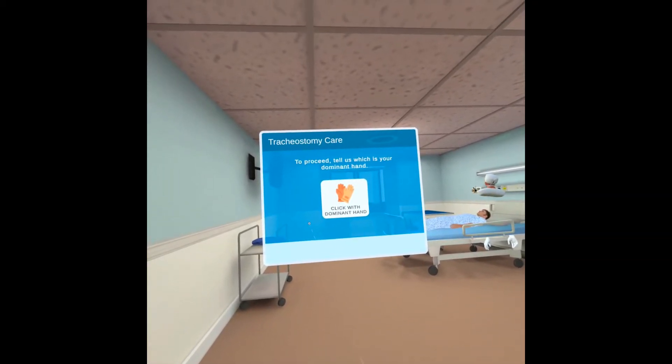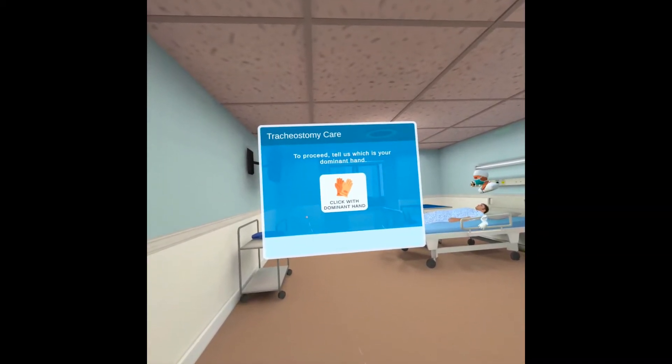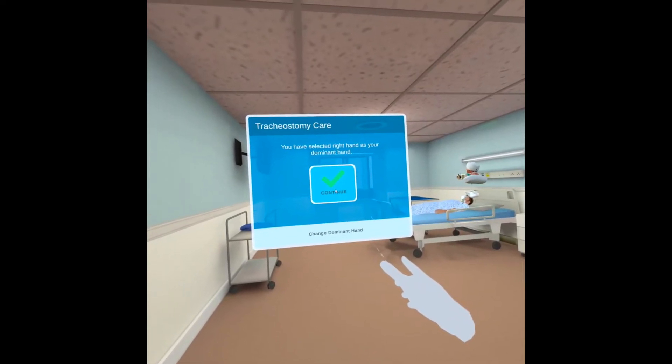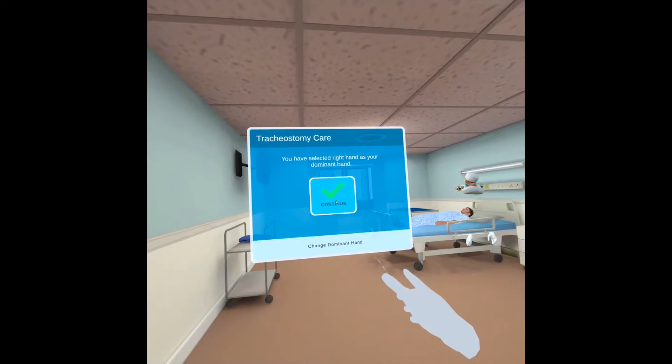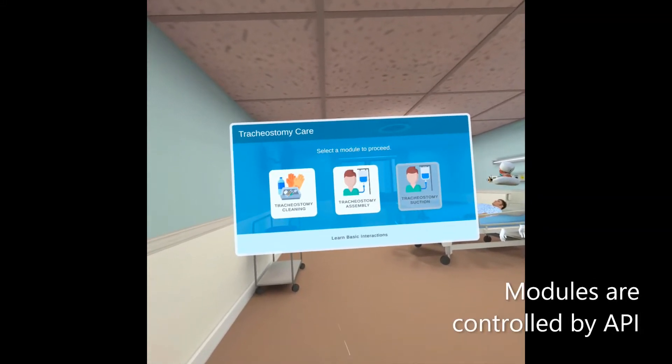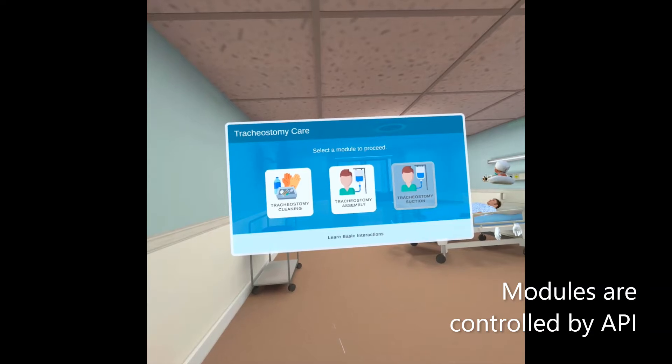Please tell us which is your dominant hand by clicking on the button with your dominant hand. You have selected right hand as your dominant hand. Click continue to pick a module. You are now ready to begin the training. Please select a module from the menu to get started.